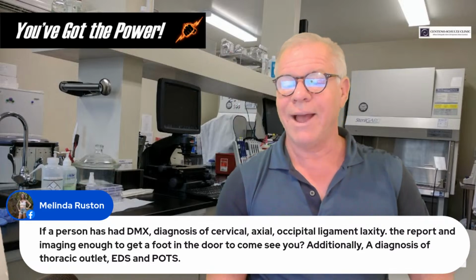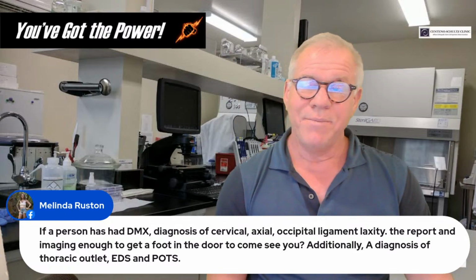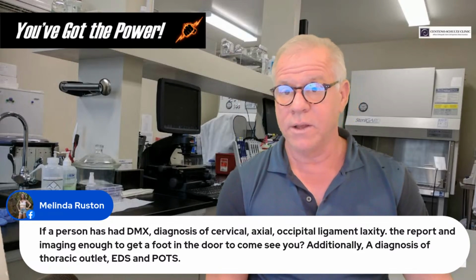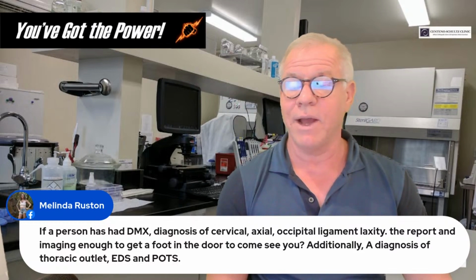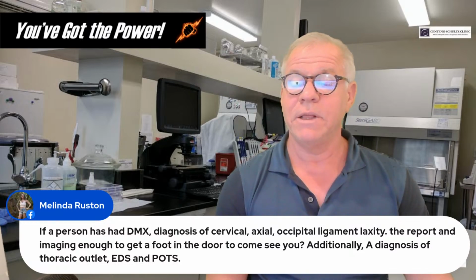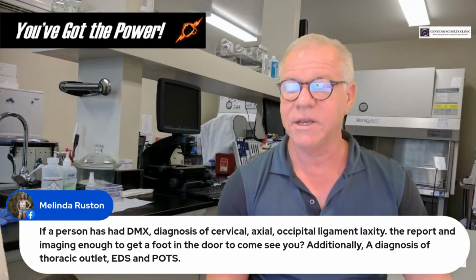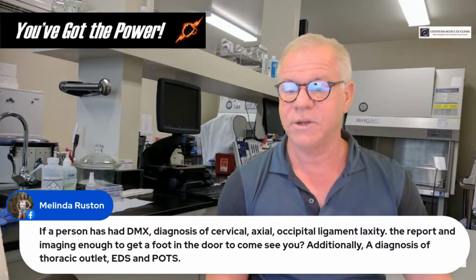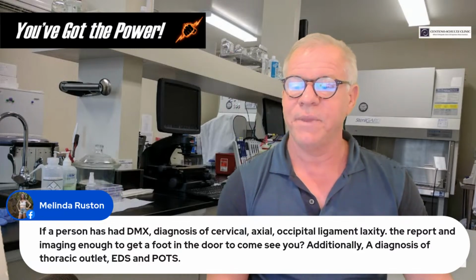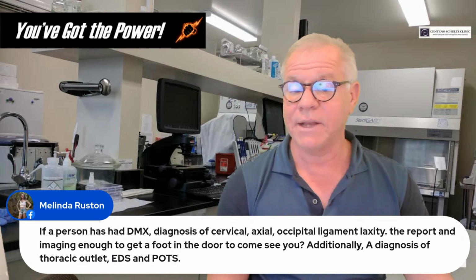Now, the only thing I'll rely on the report on is the measurements. But in my experience, half the time those are wrong, meaning that we can find the correct measurements off the person's MRI DICOM file. And when we look at those measurements and compare them to what's on the DMX, I can then double check to make sure that those measurements are in fact correct on the DMX. So again, I think a DMX is great.